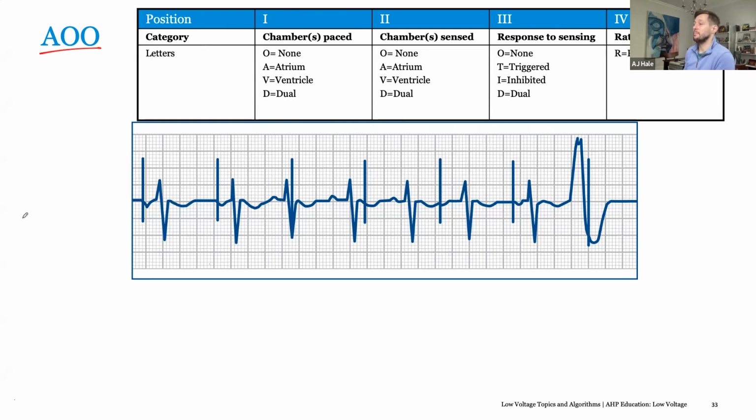Okay, we're good. The only advantage of an atrial-only device is maybe if they just have some degree of sinus brady or sick sinus syndrome, they can get support without worrying about occlusion. It's a simpler device. It's cheaper. Down the road, you stick a bunch of leads in there and they're more likely to develop occlusion. You can get SVC syndrome, or it could be harder to extract if they get infection. So the argument can be made, it's cheaper and easier just to put in an atrial-only lead.